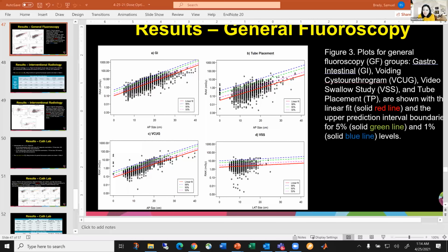So does it mean the software company should help us rearrange to get the same unit when we send those data? Yes. If you look at Radiometrics, all of those vendors put the information into Radiometrics, but Radiometrics has only one unit. So yes, it's a little simpler that way.